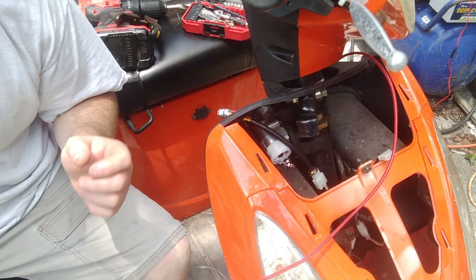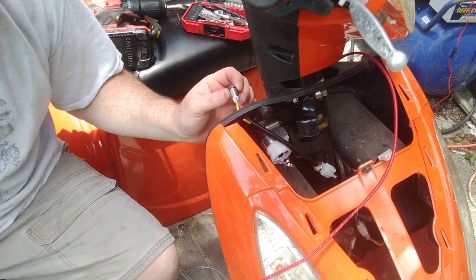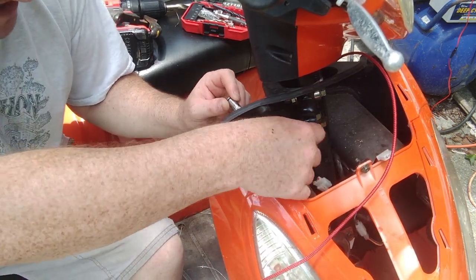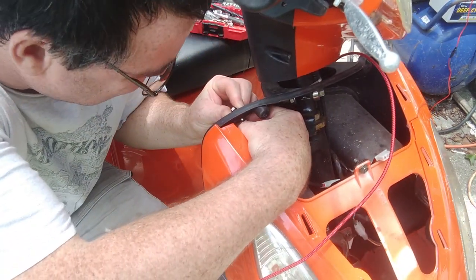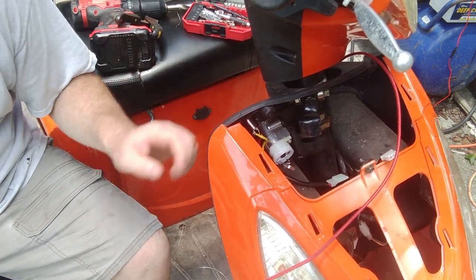Alright, that was a pain in the butt trying to hold this and not being able to see, but I got it soldered on. So now I'm just going to slide this back through, tighten that bolt real quick, and just like that we've got a power button that works.